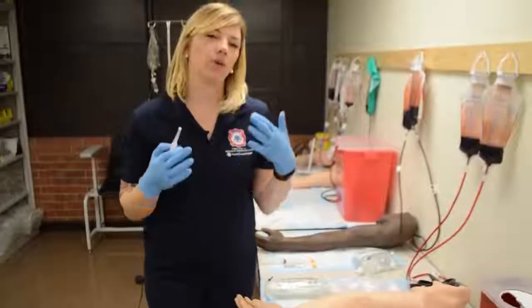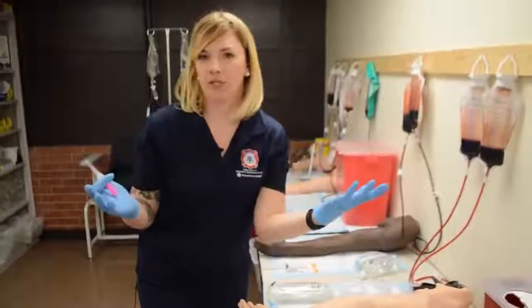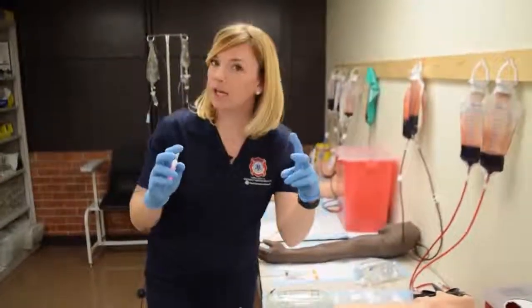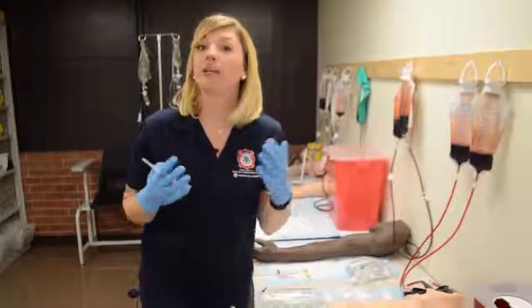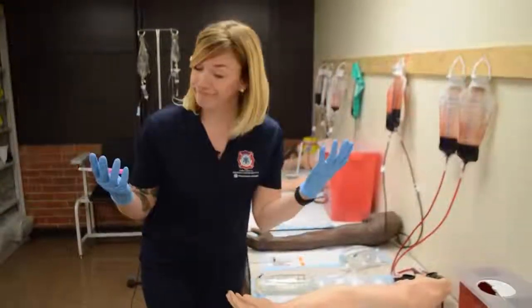Here's the tip. So let's say you get underneath the skin and, oh my goodness, you lost your vein. We need to re-find it. Instead of digging around, or what we call fishing, I have a quick tip to show you how to redirect your needle and not cause your patient a lot of pain.